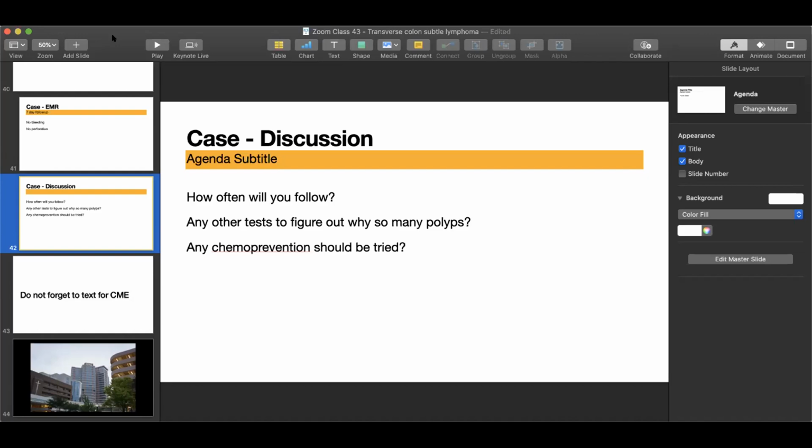I strongly suggest that if you are going to use optical diagnosis with proper IEE, you use a near-focus capable pediatric colonoscope. Otherwise, you will have this feeling of, oh, I see it, but maybe I'm not so sure, because you're not highly confident in the diagnosis.